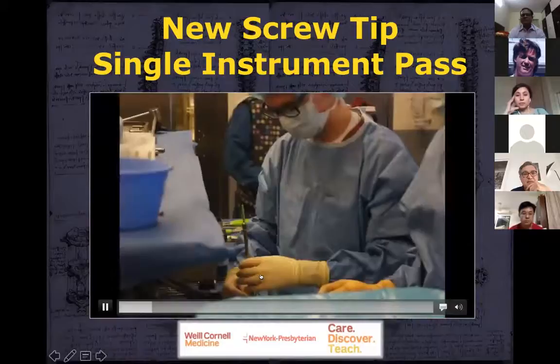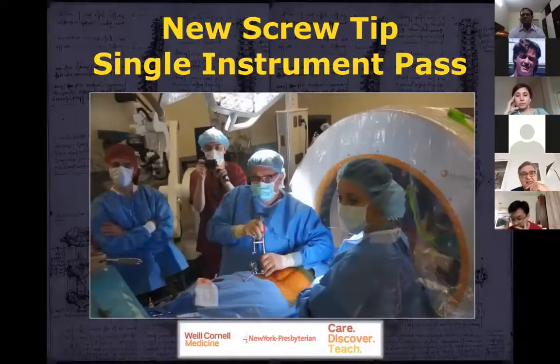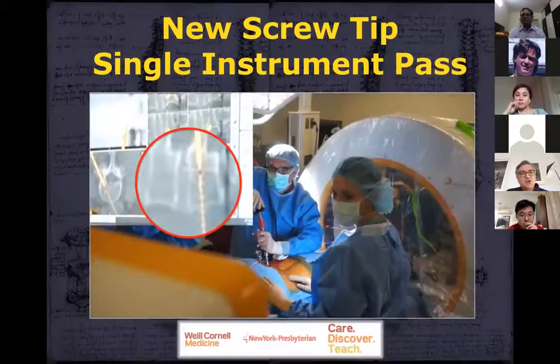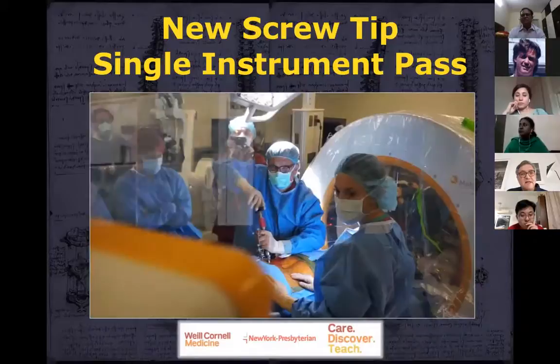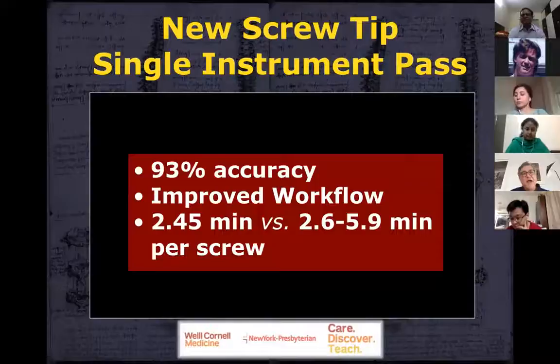So that's the pedicle screw. It's navigated, as you can see here. That's the tip of the pedicle screw. And we register it for the navigation system. We have a small skin incision here. We tap, so the K-wire that's sticking out attaches to the bone. And then we insert the pedicle screw under direct navigation. You can see here that you really have to obviously make sure that you penetrate the bone. So we've used this pedicle screw now maybe for a year and a half or 2 years, and we've been very happy with this. Every pedicle screw takes about 2.5 minutes and is very accurate overall.